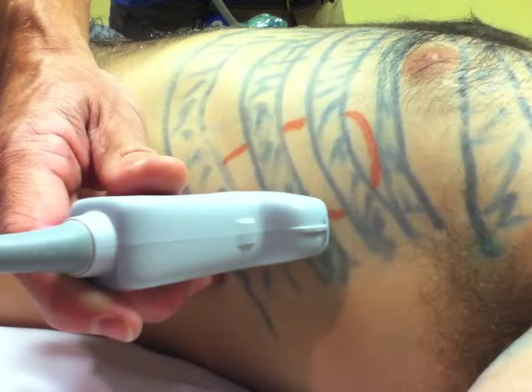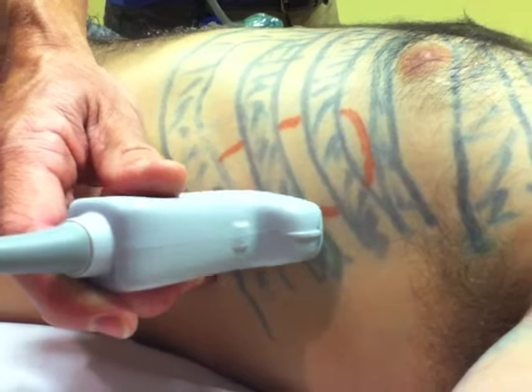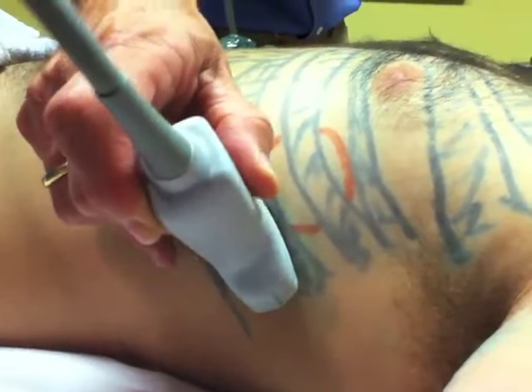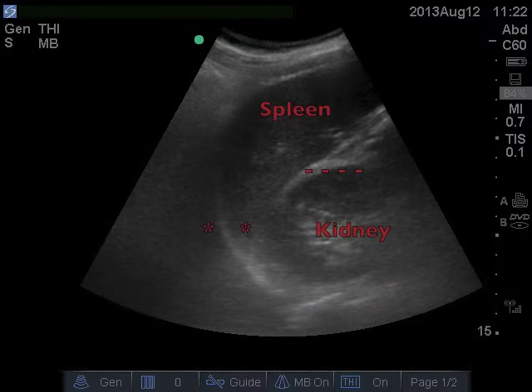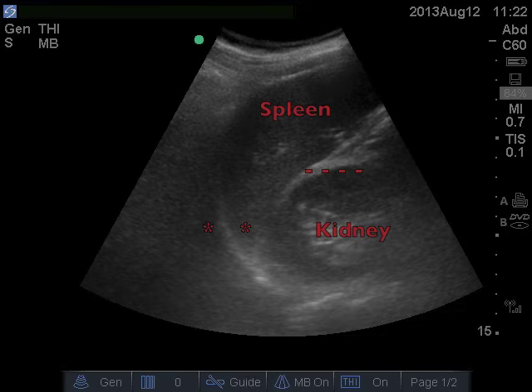Next, move to the left upper quadrant. You can see that the spleen is much smaller and more superior than the liver — it is also often more posterior. So if you're having trouble with this challenging view, move your probe more posterior and superior. At times, you may have your probe close to the bed posteriorly and the axilla superiorly. After finding your window, you can oblique the probe and rock it to find your view of the splenorenal recess, as well as the region between the spleen and the diaphragm, and above the diaphragm.